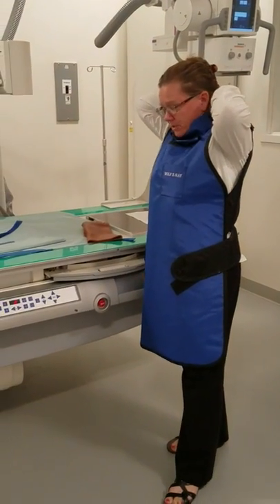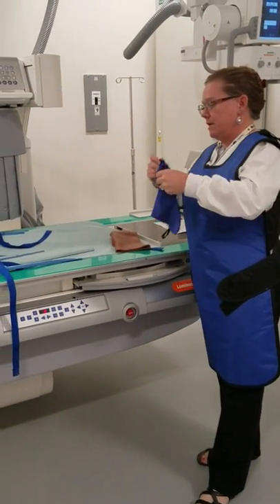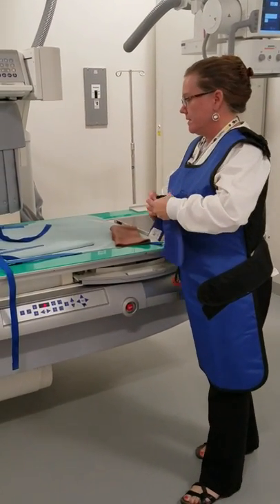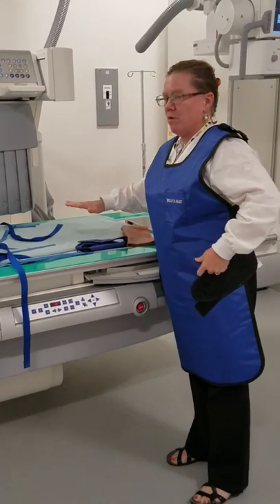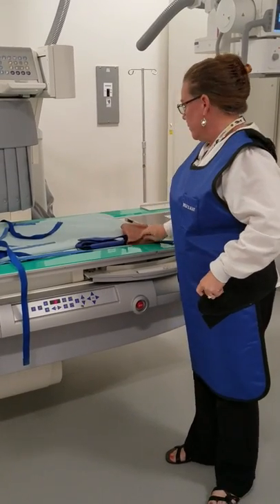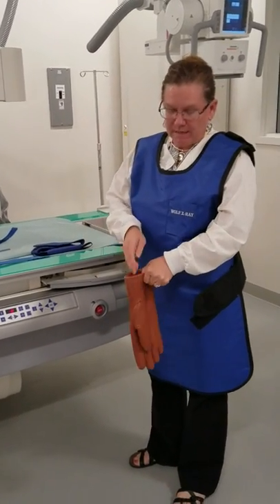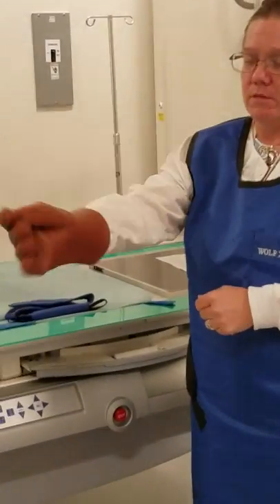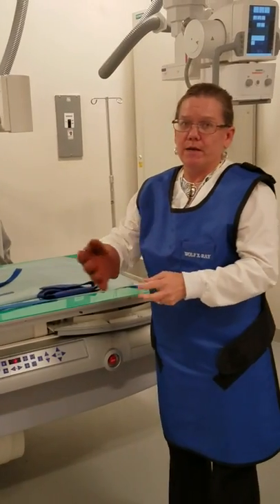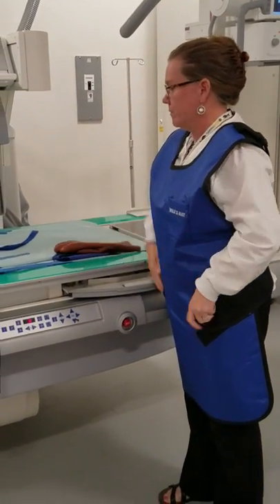When the radiologist is doing an exam, he may need to slide his hand up underneath and feel the patient. When he does that, he'll put a lead glove on to protect his hand when it's up underneath the fluoroscopy beam.